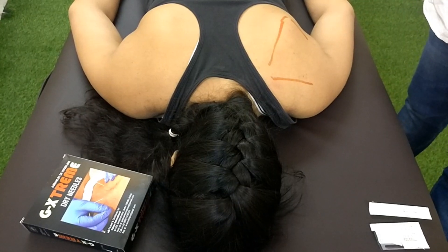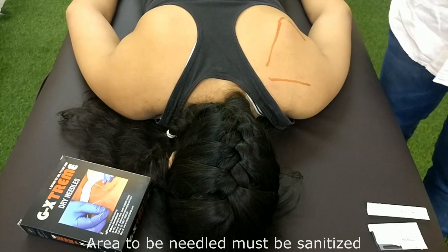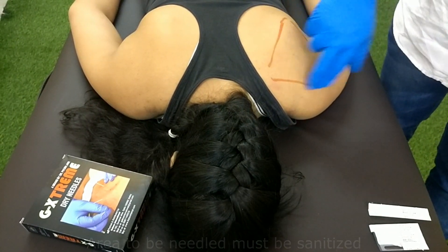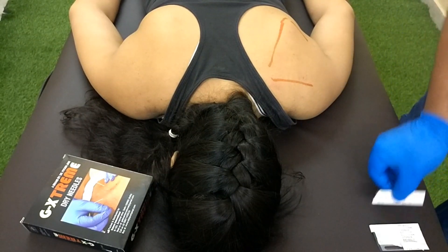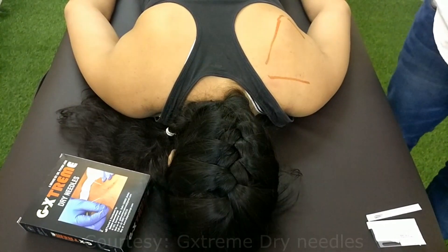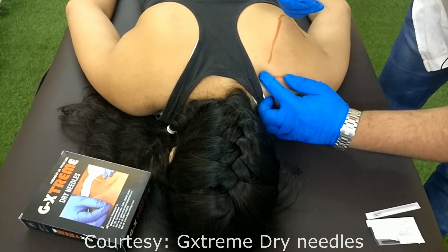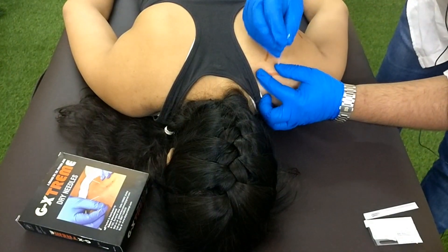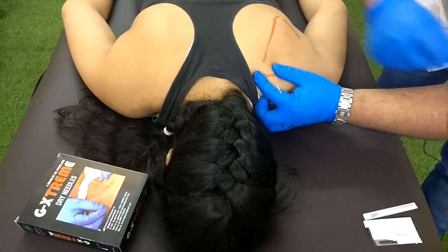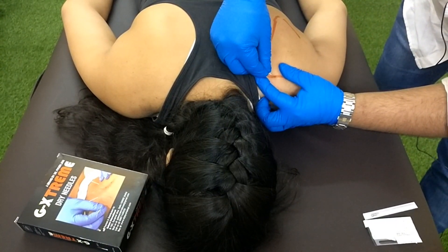To needle the supraspinatus muscle, we will be palpating the bony landmarks — the medial border of the scapula and the spine of the scapula. We will be using a 40 mm needle. To be on the safer side, keep one finger on the medial border of the scapula and thumb on the spine of the scapula. Tap the needle very close to the spine of the scapula and angle the needle towards the acromion.